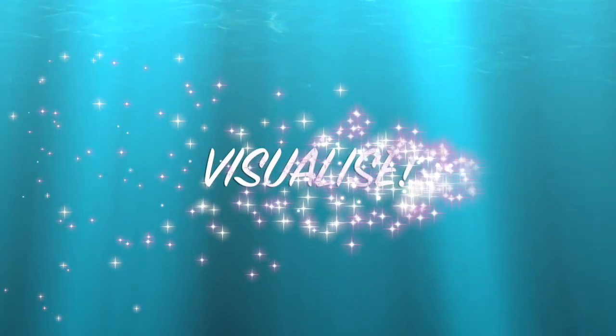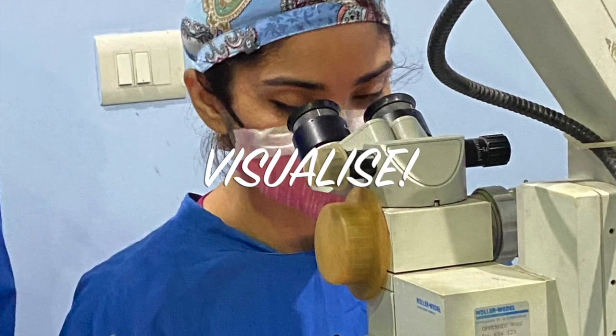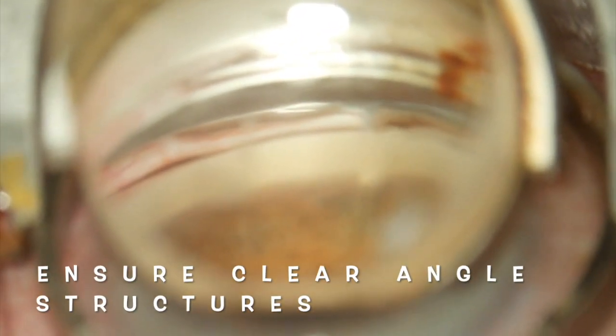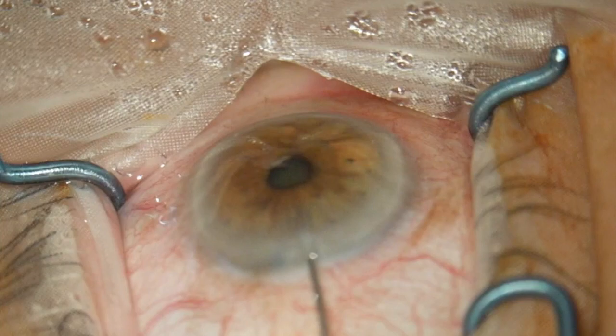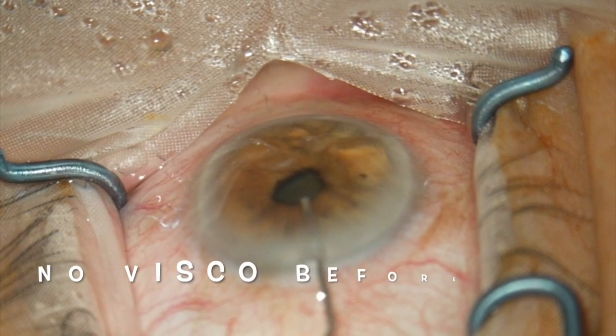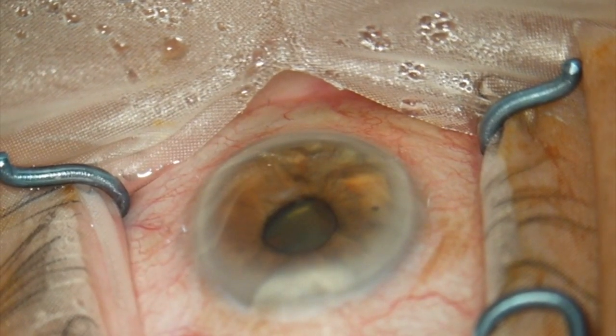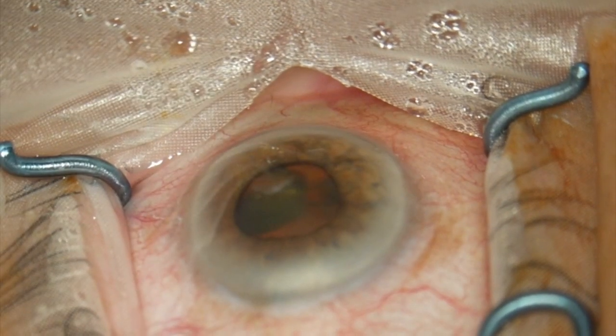Start your surgery with very good visualization first of all. You must have a good microscope. If you don't see well, you're bound to not have good outcomes. Don't use viscoelastic prior to trabectome. You can create a blur or generate air bubbles and make it harder for you to identify the trabecular meshwork.